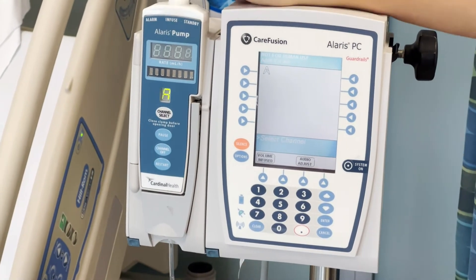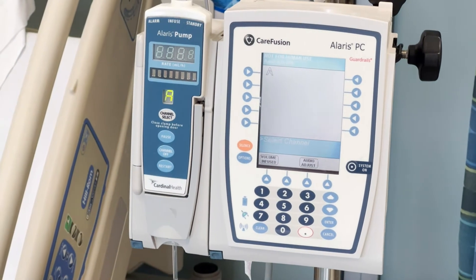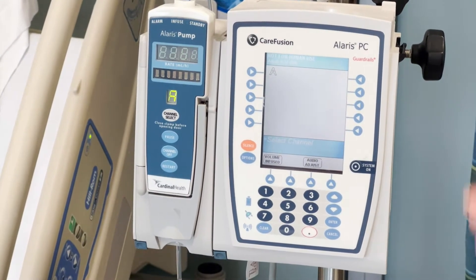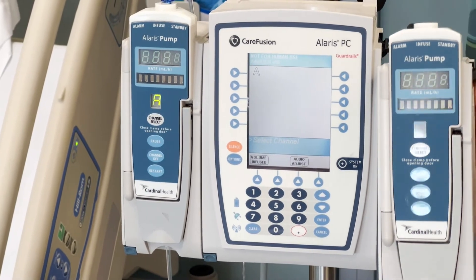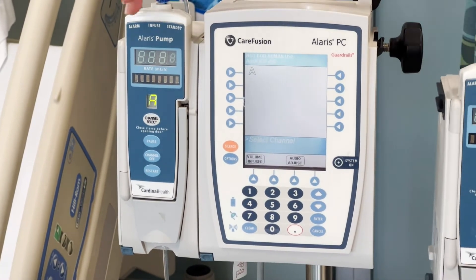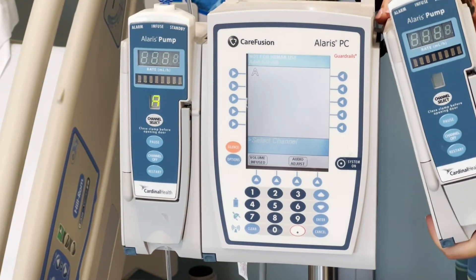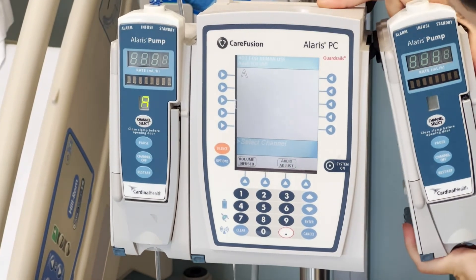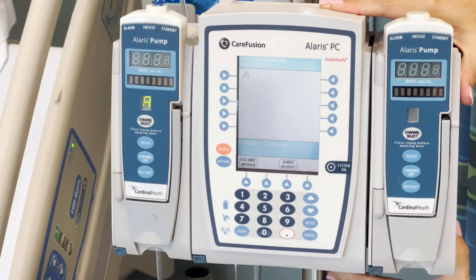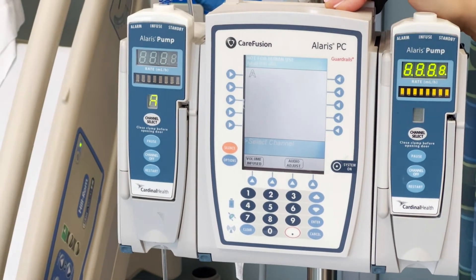Then we will select the channel. These pumps can have multiple channels depending on how many fluids or medications you're giving. You'll always start on the left side with channel A. And then if you add another one, you put it in at an angle here and then lock it in. This will now be channel B.